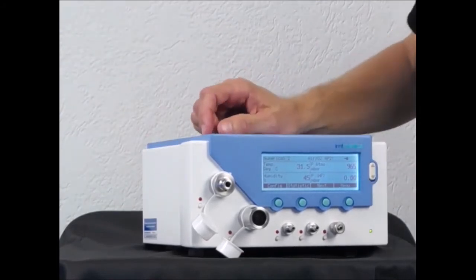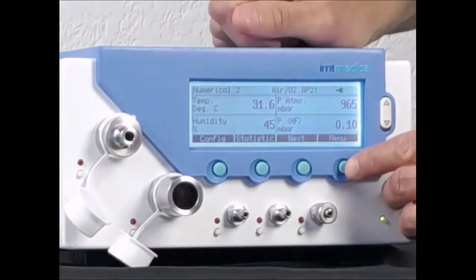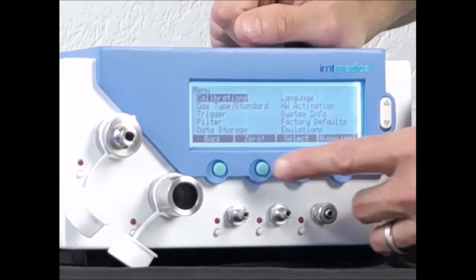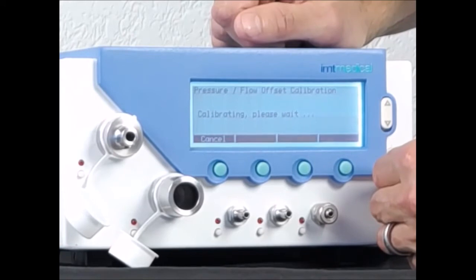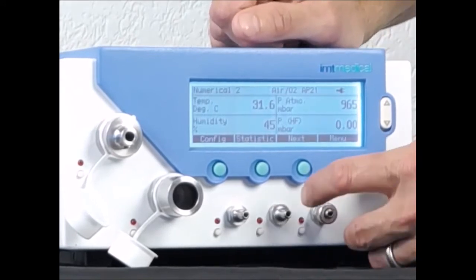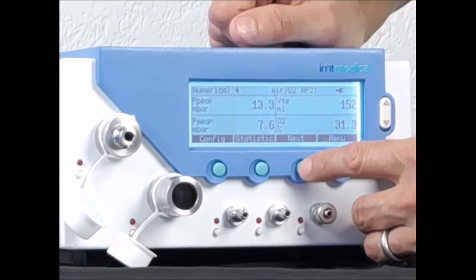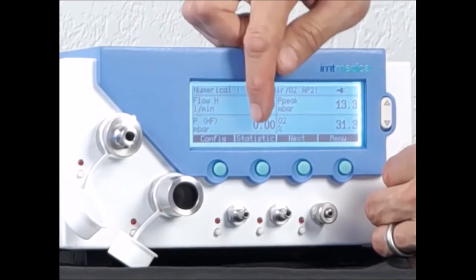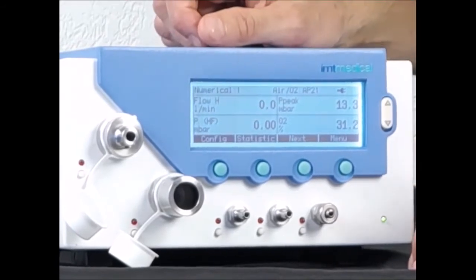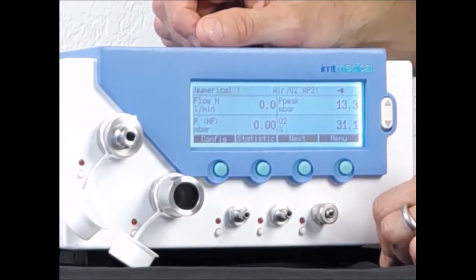Then I perform the zero operation. It is here in the menu — zero — and it takes a few seconds, then all the measurements are zeroed. We can see that on the flow here: flow is zero, pressure is zero. These two values need to be exactly zero, and then my offset is corrected correctly.